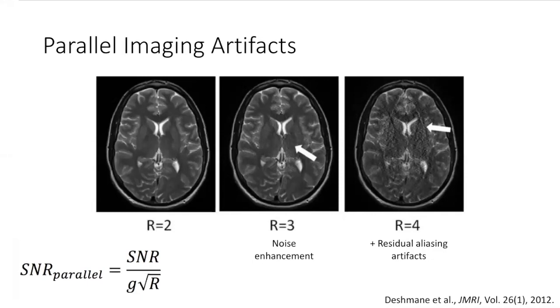But as you get to higher fields, and I do have an artifact towards the end where parallel transmit is actually the solution, it is just more challenging and also more expensive. But if you plan on doing 7T work, that's where you're probably going to need parallel transmit. So anybody interested in Bay 2 might want to think about that. So that's about it.